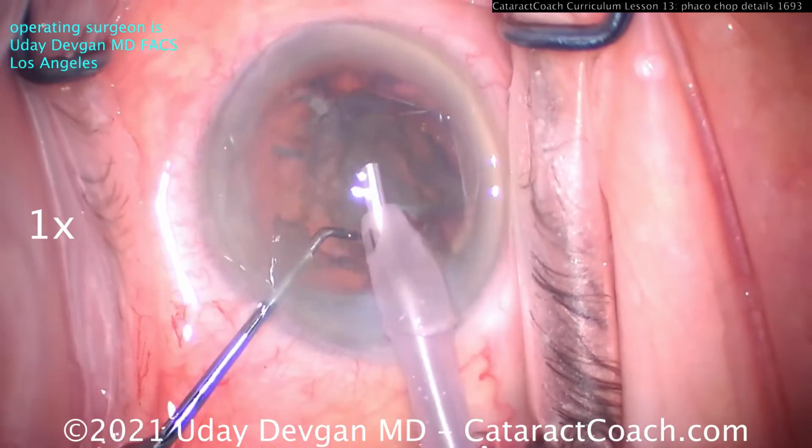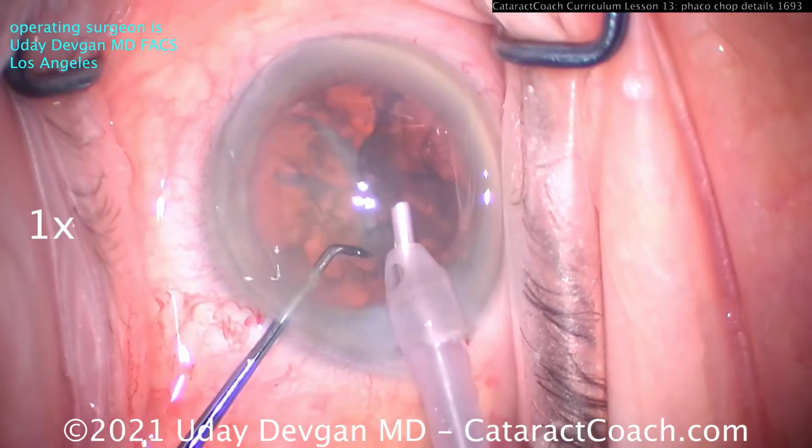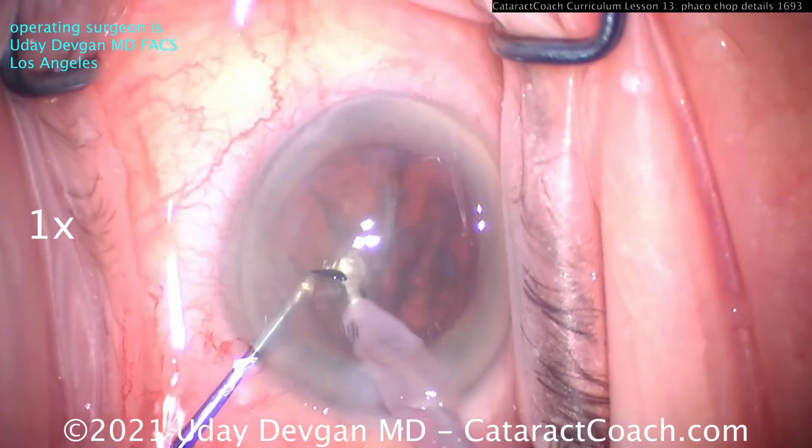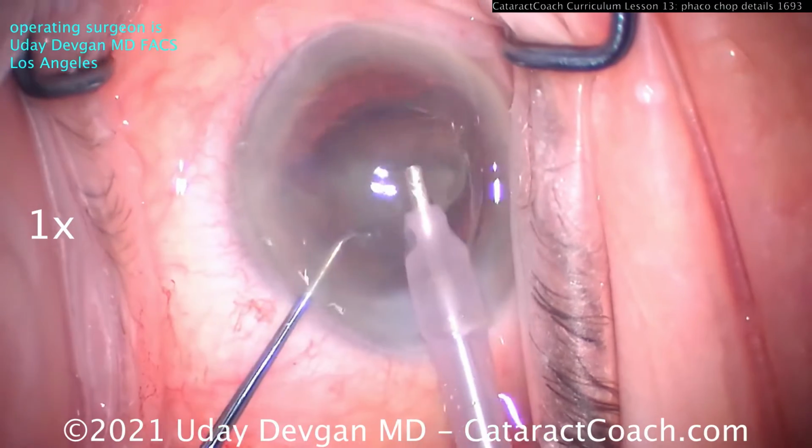Now we need that 5 millimeter capsulorhexis in order to bring out an entire half. Now you could sub-chop this within the bag into quarters, but let's just do halves. And then you can bring a half up like this, and now that can be sub-chopped very easily.